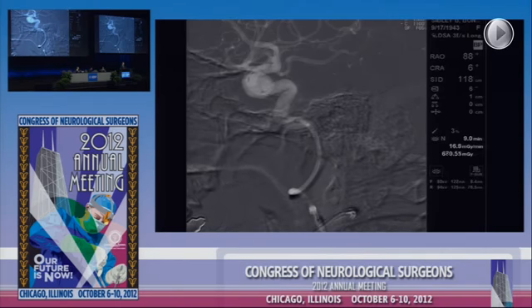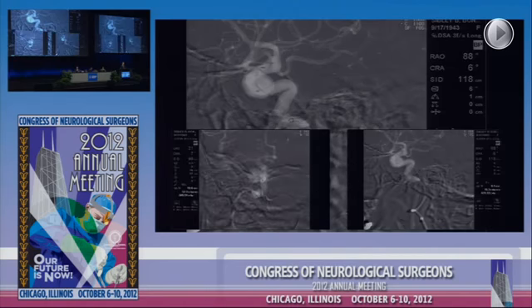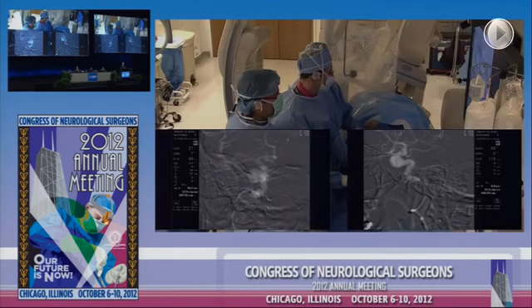We're now crossing the neck of the aneurysm. You can see we have the wire. And if you look on the lateral, we're going to try to avoid this very large PCOM vessel. She has a PCOM. You can see the wire trying to navigate past that PCOM. We're a little bit stuck there, so we're going to back it down. We definitely don't want to perforate anything. Try to rotate off it.